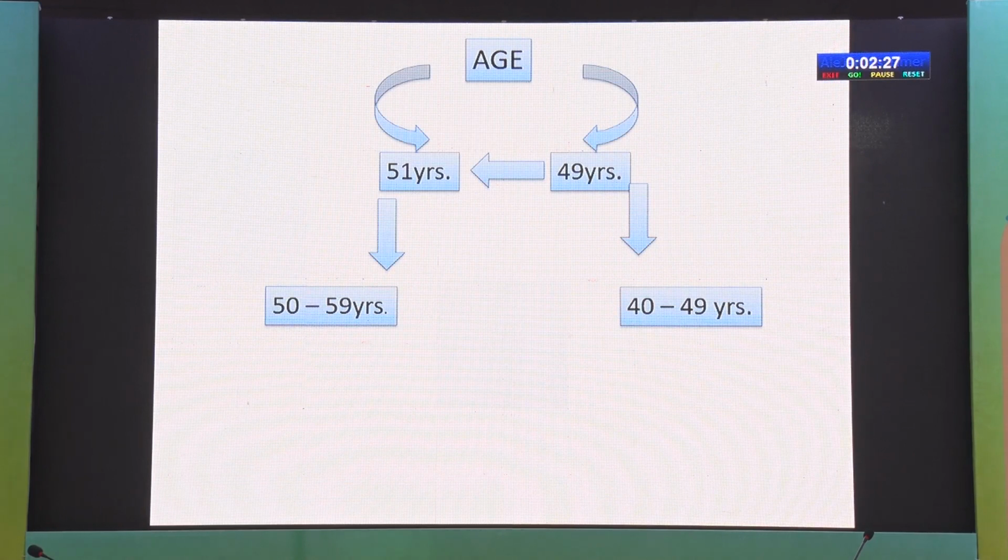If you enter a wrong age, the patient's data is going to be compared to a wrong age-matched database, and so you'll get a meaningless result.